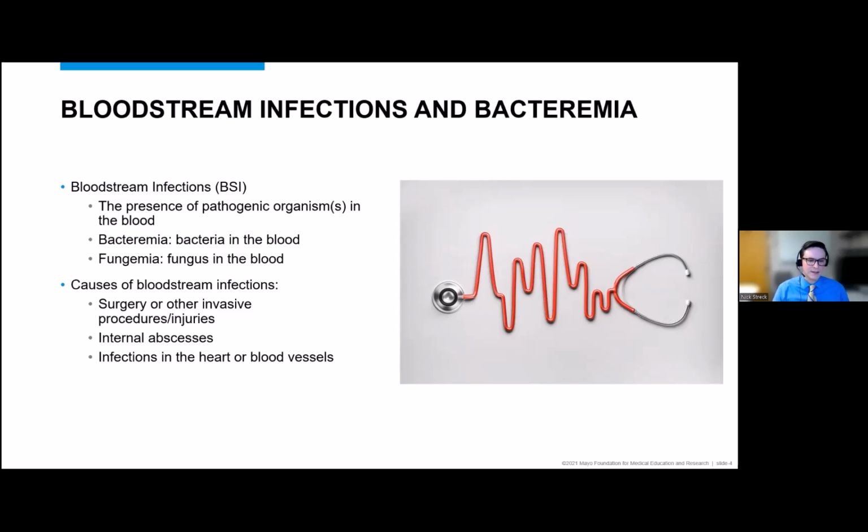And that's a key distinguishing factor between the other terms that we're going to discuss, because it can sometimes be difficult to assign clinical importance to the work that is being performed in the laboratory, which is why the blood culture collection process is so important.